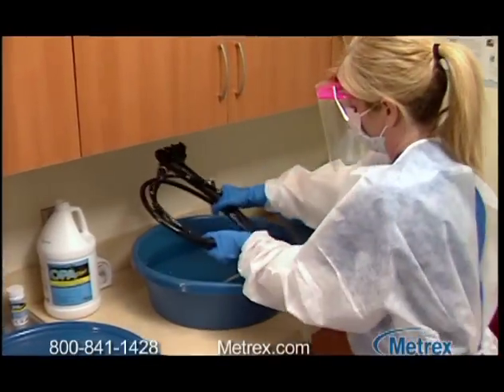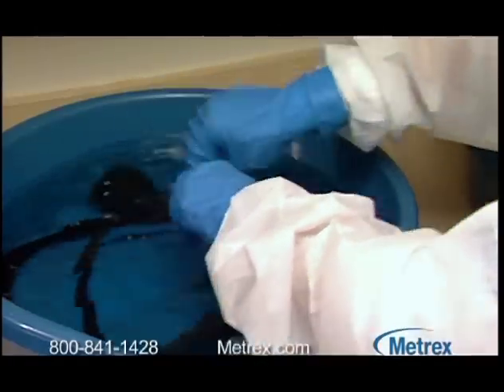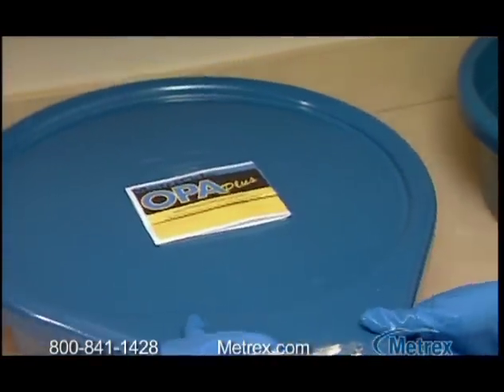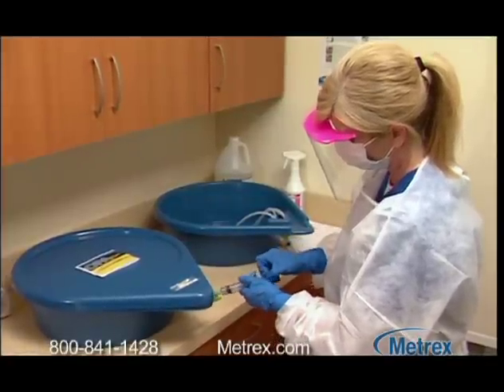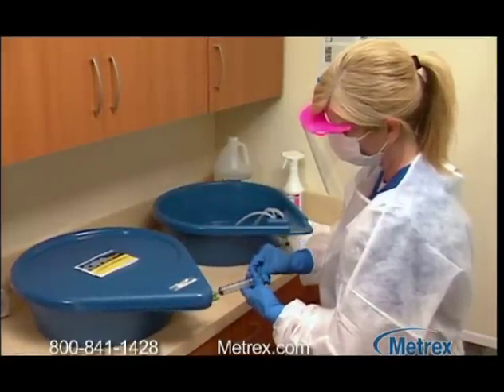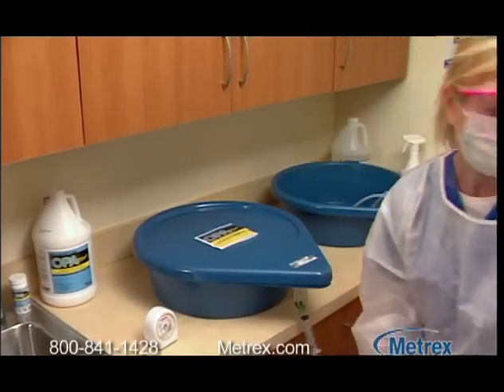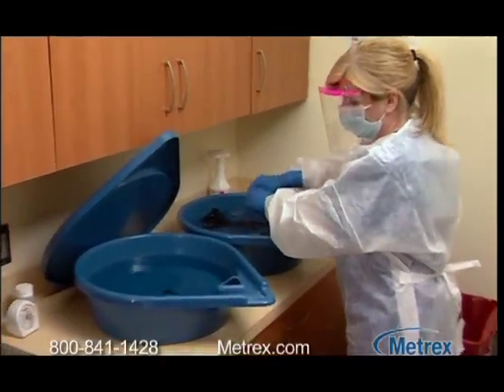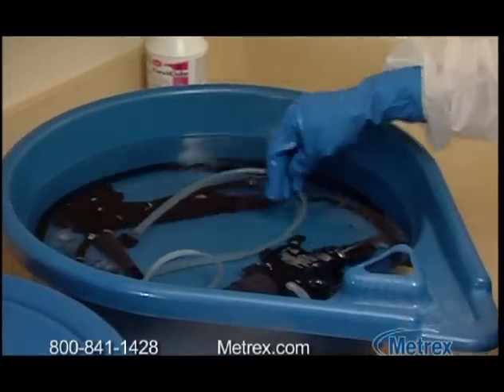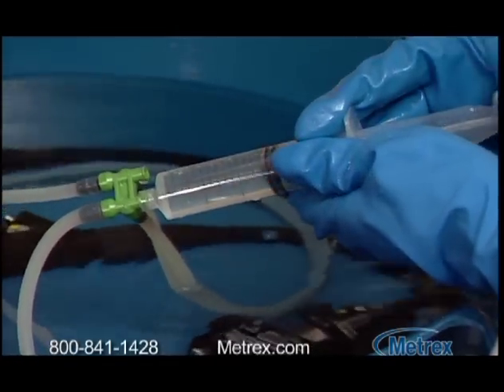If you're performing manual reprocessing, immerse the instrument completely in Metricide OPA Plus. To prevent exposure to fumes, avoid evaporation, and prevent particles such as dust from falling into the solution, use a cover. Fill all lumens and channels if applicable. Soak the instrument in the solution for 12 minutes at a minimum temperature of 20 degrees Celsius or 68 degrees Fahrenheit to destroy pathogenic organisms. When the disinfection time is complete, remove the device and rinse thoroughly by immersing completely in a large volume of fresh or sterile water, following your facility's protocols. Keep the instrument totally immersed for a minimum of one minute and manually flush all lumens according to instrument manufacturer instructions.